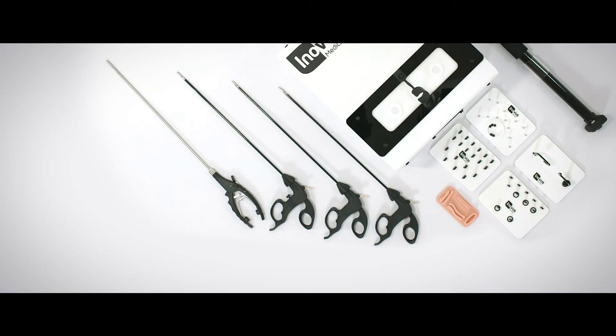The simulator comes with four laparoscopic instruments, including a Maryland's grasping forcep, a ratcheted Johann's forcep, laparoscopic scissors, and a laparoscopic needle holder.